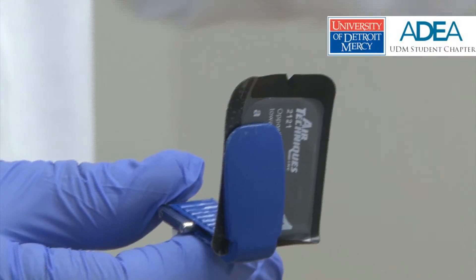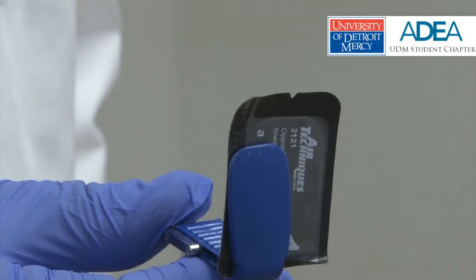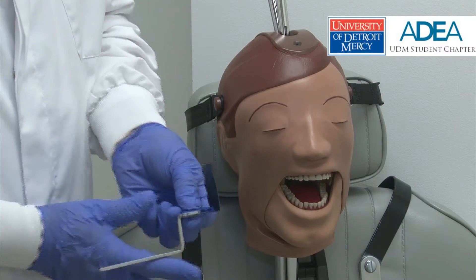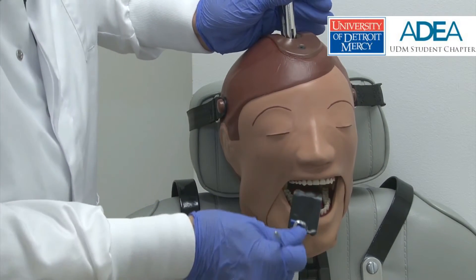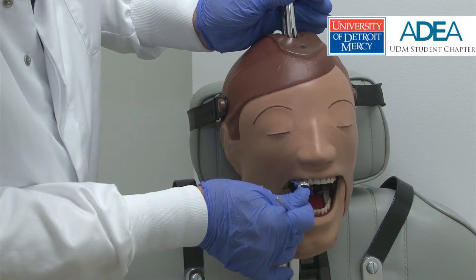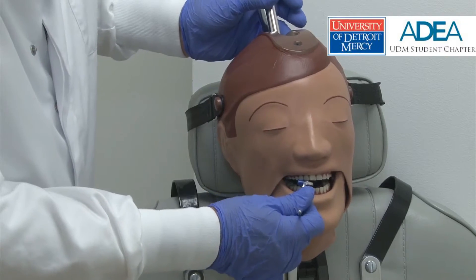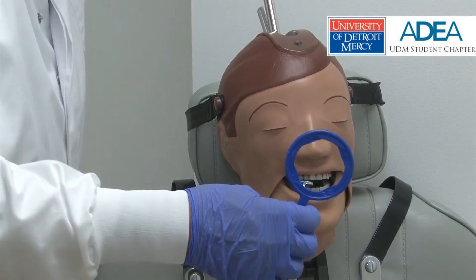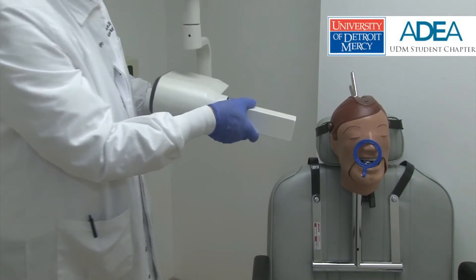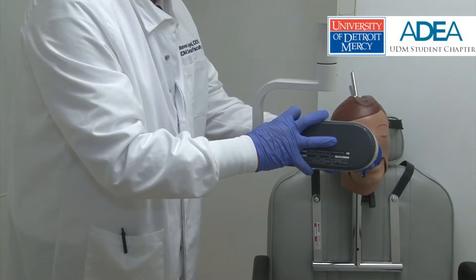The number one sensor is placed vertically in the blue anterior periapical holder, with the guiding arm placed in the apical direction. The patient is asked to open, the sensor is placed in the roof of the mouth for maxillary exposure using external landmarks to guide its position, and the patient closes against the bite stick. The orienting ring is placed in position and the collimator, placed in the vertical orientation, is aligned for the image.